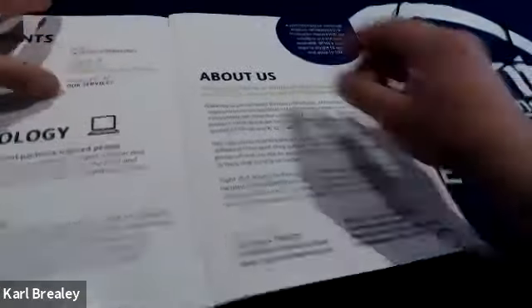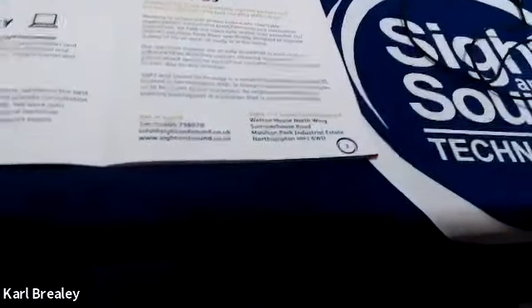Page 7, desktop magnifiers. Pages 8 to 9, zoom text magnification software. Right, what I'm going to do, I'm just going to stop that. That's my fault that it's picked up the second page as well. So basically what it started doing is reading down this page. What this can do is, right, we'll go through the functionality to start with.